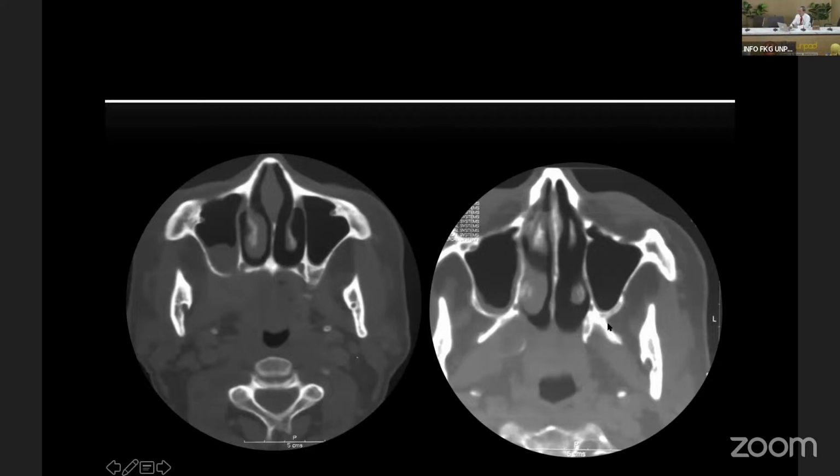This is a lateral pterygoid plate of the sphenoid bone, all right? This is the medial pterygoid plate of the sphenoid bone on the left side. But if you look here, that's the lateral pterygoid plate of the sphenoid bone, but the medial pterygoid plate was destroyed or partially destroyed. And you can probably see there's a sort of soft tissue mass here.